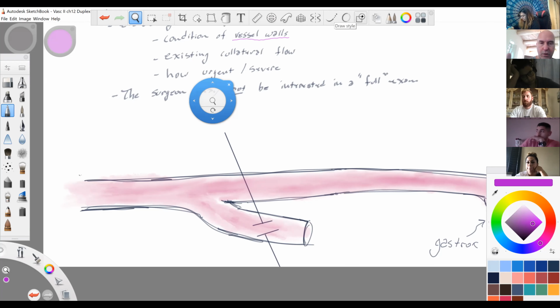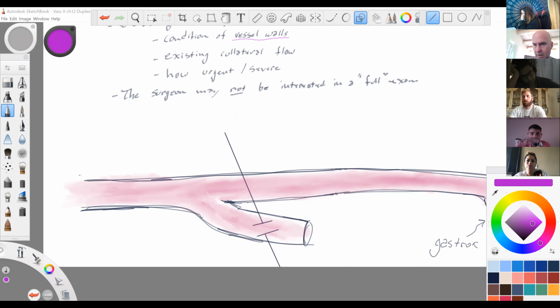So I've got a little artery here. I've angle corrected there. Don't expect to find triphasic flow in this particular artery. And this artery doesn't go all the way down the foot. It dissipates into multiple branches rather quickly.